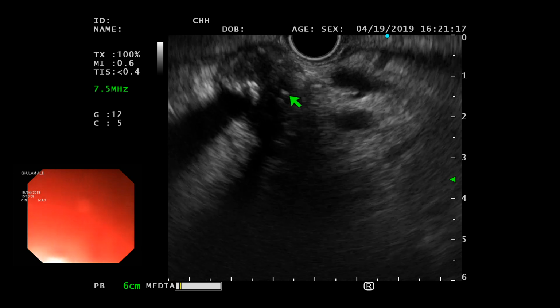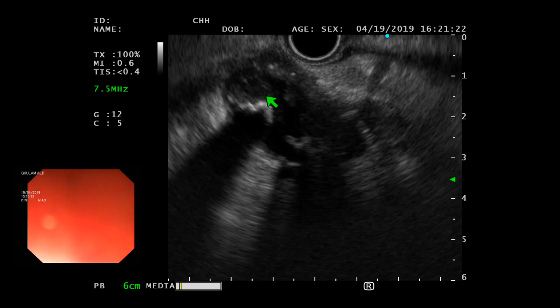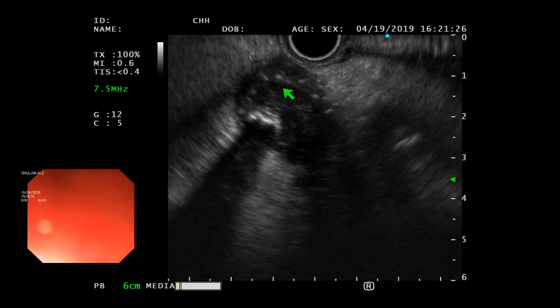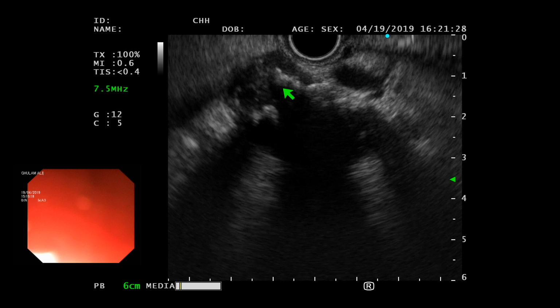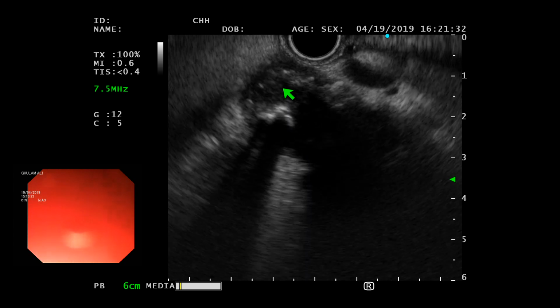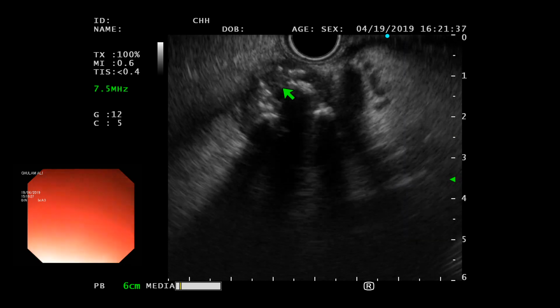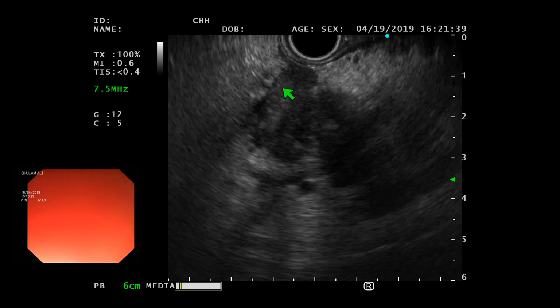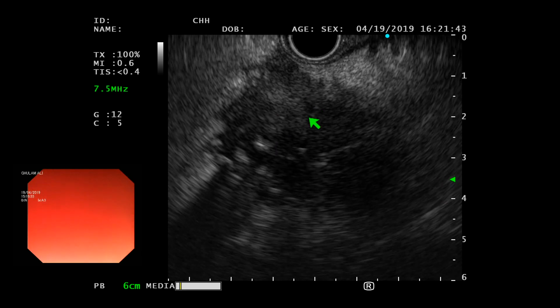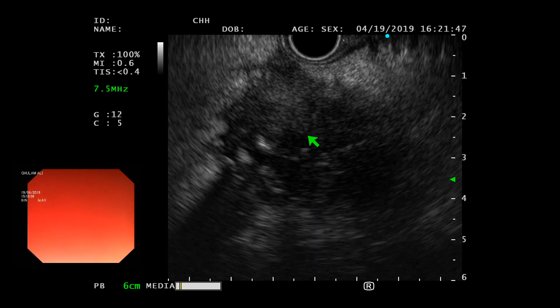But look at the difference. The necrosis, when you see those whitish lines in there, feels like there may be some fluid in there, and it's a little more like a vein, like blood. When you look at the IVC, the way that flows around, that gives an impression of that. But here, this area is more organized tissue, right? So that's what bothers me here.